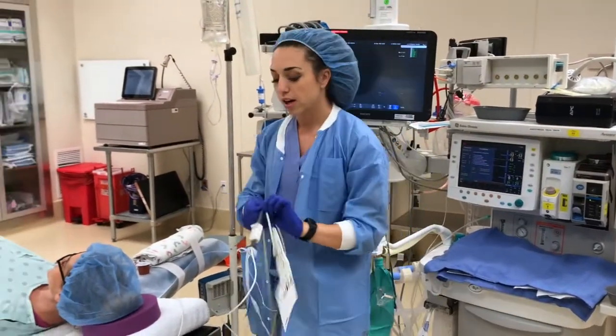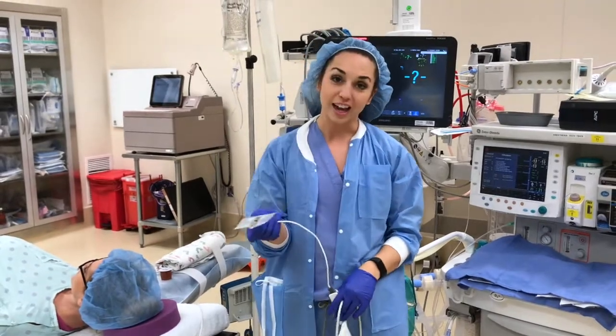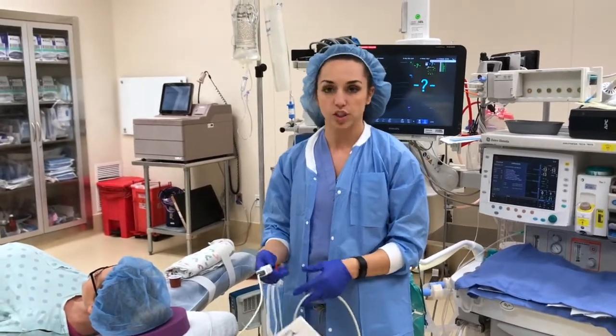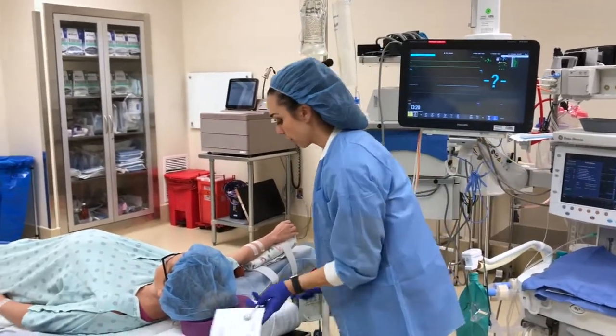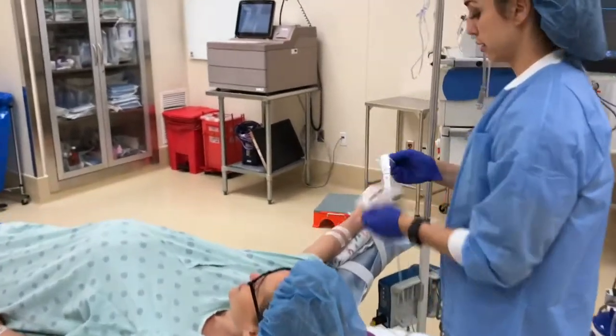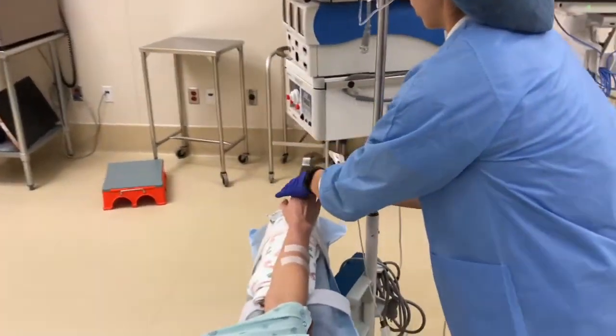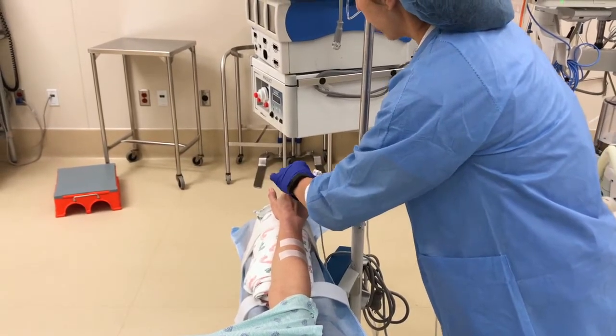So again, remember, just in general for anesthesia, generally pulse ox goes on the IV side, unless obviously there's 2 IVs, then you can't help that. So in this patient, we're going to presume that her IV is right here on the right side. So we'll place our pulse ox on the side. Remember to try to place it on a finger where she won't scratch her eyeballs out.